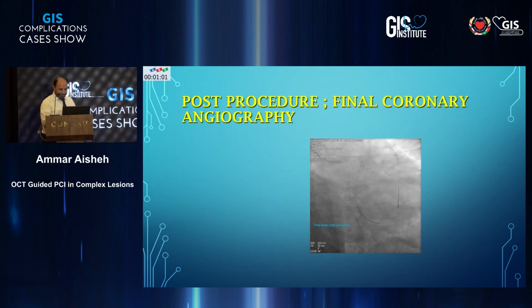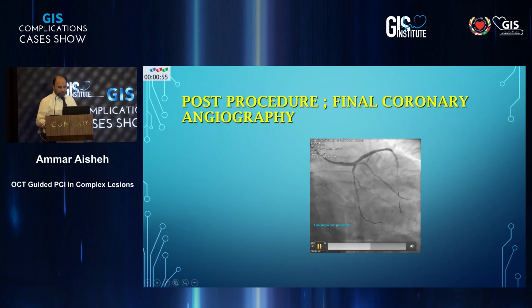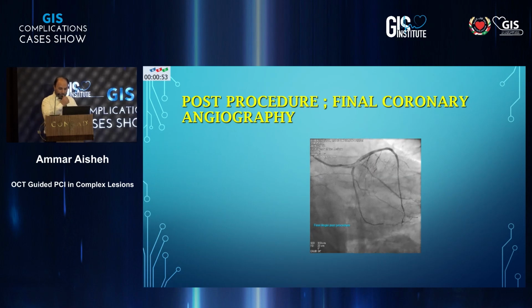Come to the end, then we'll ask Dr. Jassim to comment on that. And this is the final angiography.